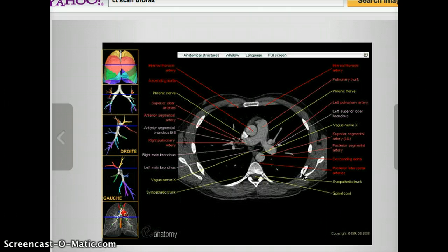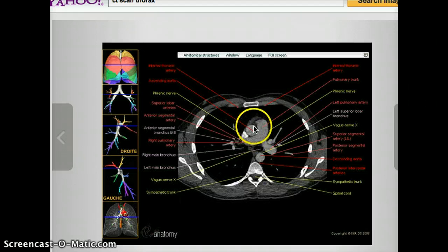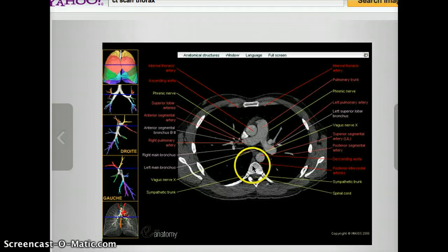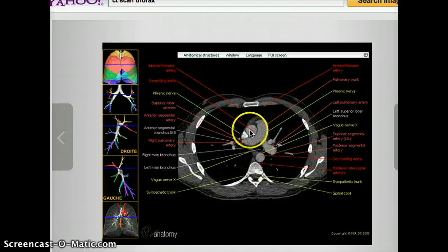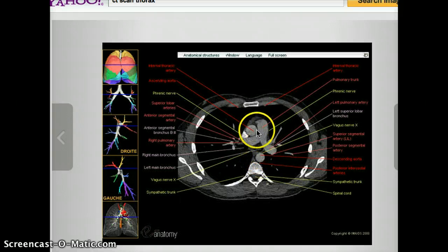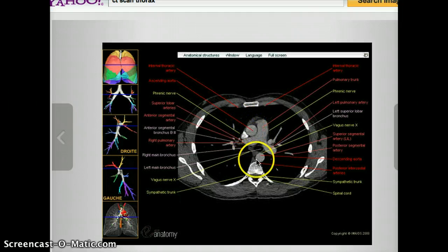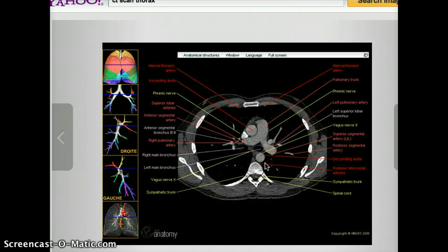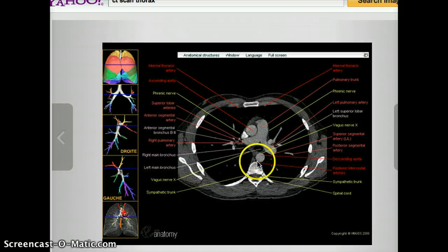In this picture we can see the two aorta. This would be the ascending because it's farther from the vertebral column, and this would be the descending — it's a little smaller and narrower. The reason we know this is the aorta is because it's so nice and round and very visible on the CT scan. Train your eyes to look at structures which are very round, which are very signature for aorta.